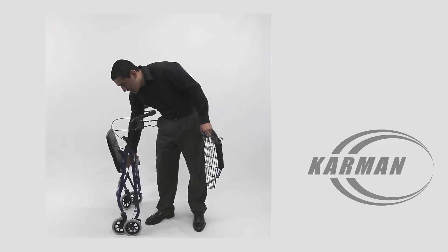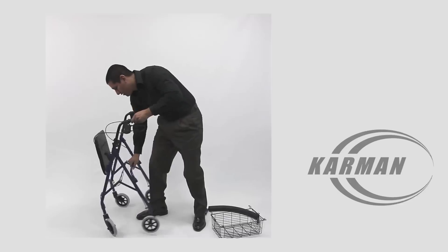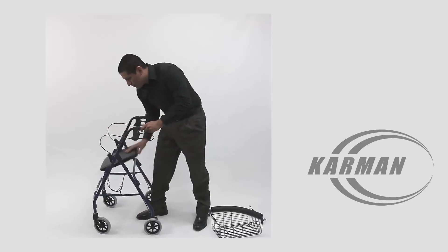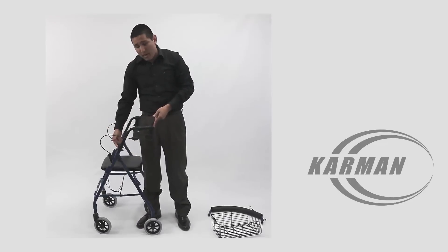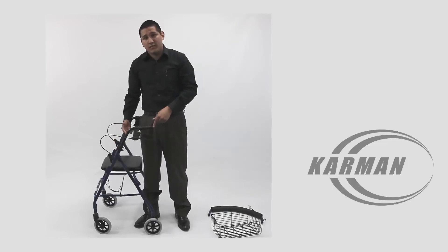This rollator weighs about 11 pounds. You can adjust the armrest from about 5 foot 1 all the way up to about 6 foot even.